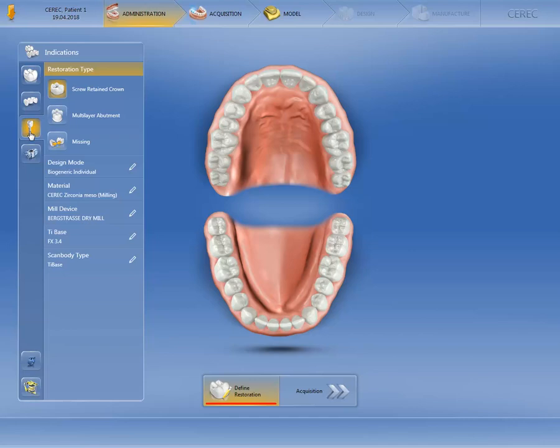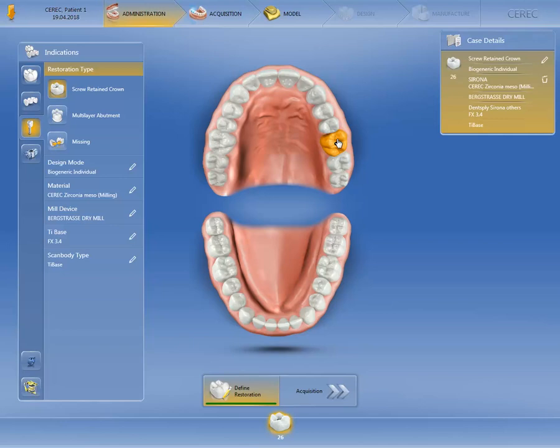In our case, we have an occlusally screw retained restoration on an implant at position 2-6. We click on the position in the odontogram and can then switch to the next phase, the acquisition phase.